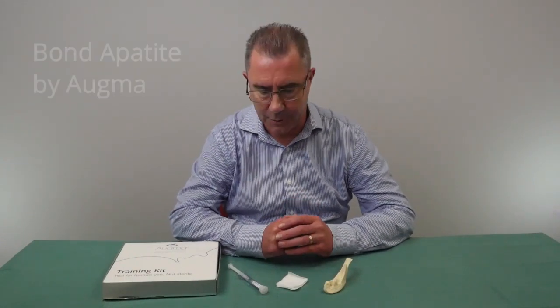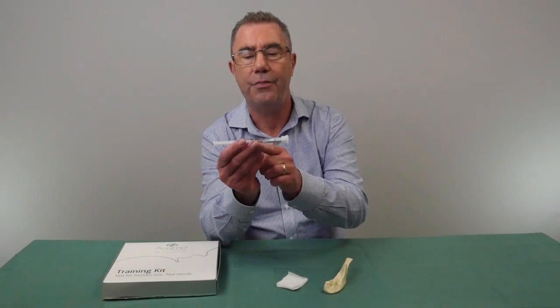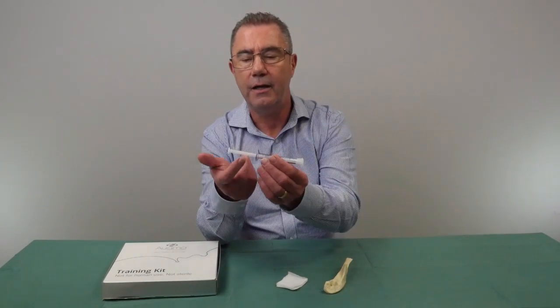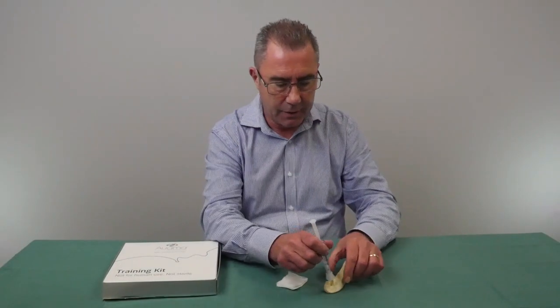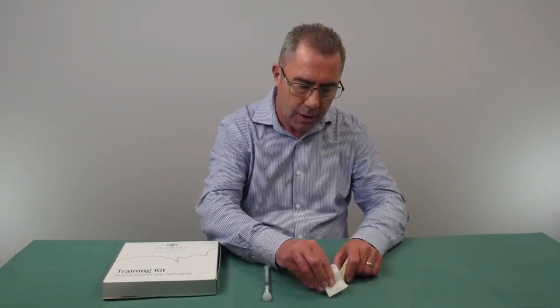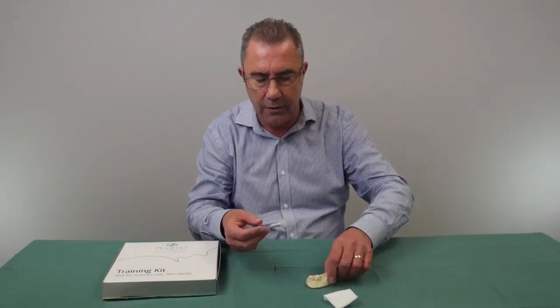Now I'll demonstrate the AUGMA Bond Apatite synthetic material. It's supplied in a syringe with powder at one end and liquid at the other. Halfway along the syringe there's a little blue line. The technique is to compress the plunger so that the liquid mixes with the powder until the plunger reaches the blue line. Then remove the end cap and dispense it into the socket. While still wet, take a dry gauze and press on the surface — the material will set hard. There's no need to use a membrane; you can then close the soft tissues over the top and suture them in place.